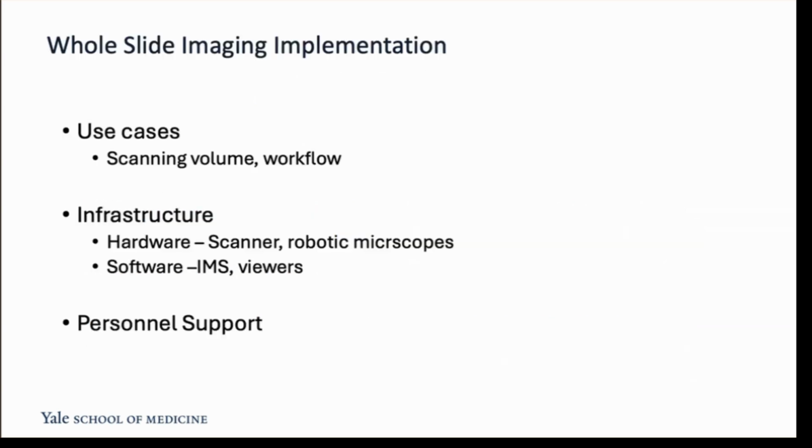And we went into the use cases, possible use cases, what kind of hardware it would need, scanning volume, whether we would need high volume scanners, what kind of low volume scanners, high throughput, low throughput, robotic microscopes, monitors, and so forth, and the workflow that we envisage to deploy some of these use cases. We also delved into what we would require from the software aspect in terms of image management system and viewers.